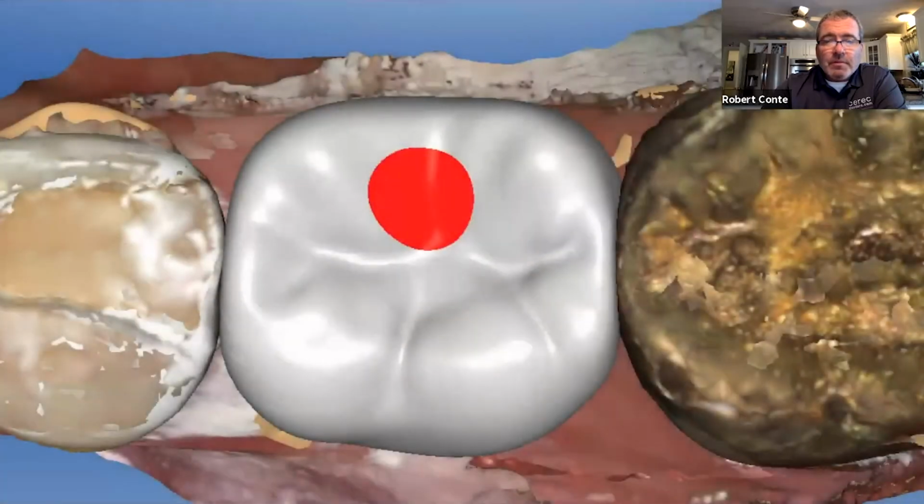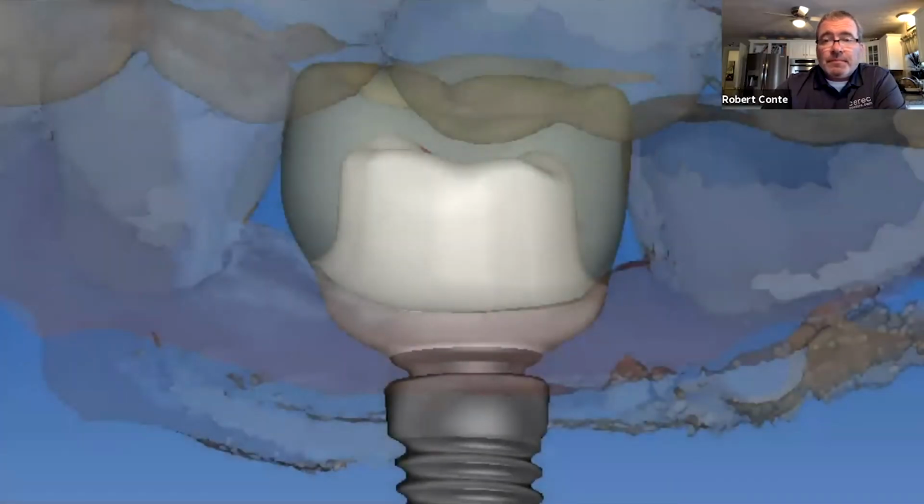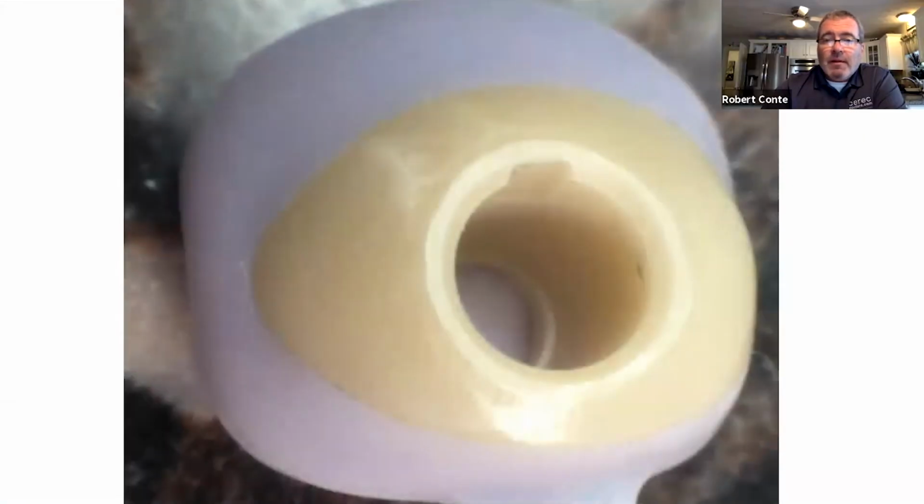Again, just going through the steps very briefly. This is where you would split the case, right? That last case was full contour. This one, you go in the software and you can actually create your abutment, and then you create your crown over the top. And it's a full control. There's the fit of the milled abutment to the milled crown. It's a perfect fit. It's a digital split, so there's no secondary impressioning. Much more accurate than you could ever do with a dental laboratory for sure.